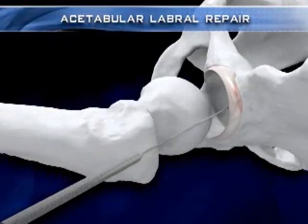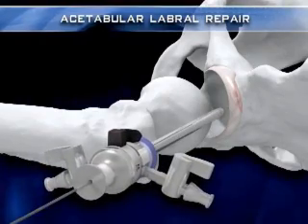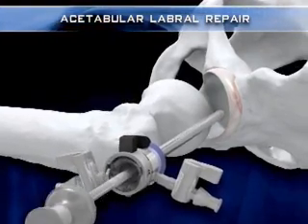The arthroscope sheath with cannulated trocar is then introduced into the joint over the wire, allowing for introduction of the arthroscope.